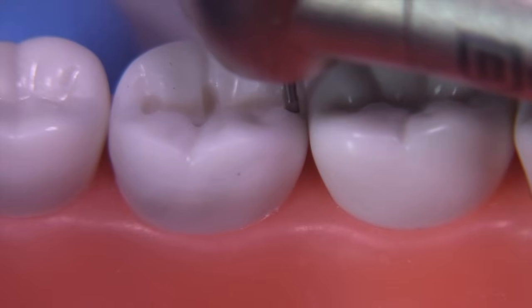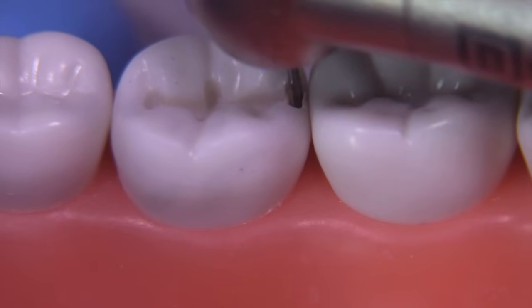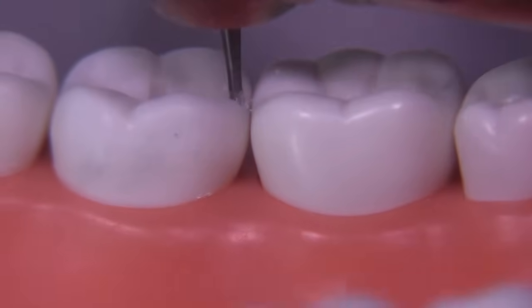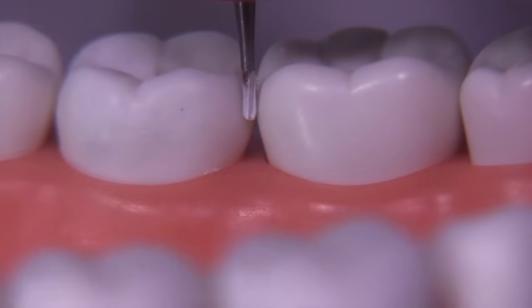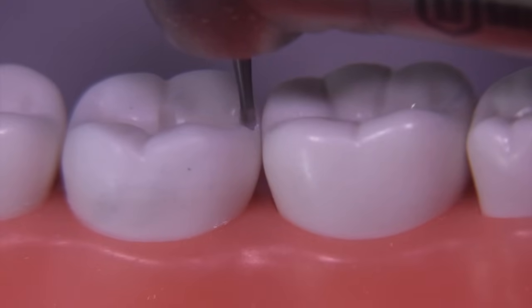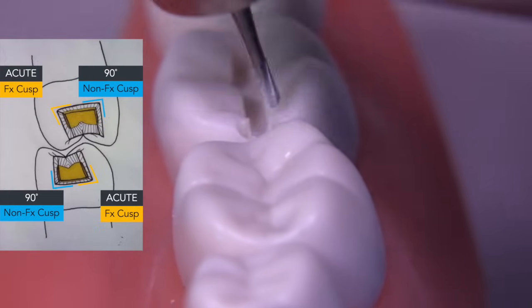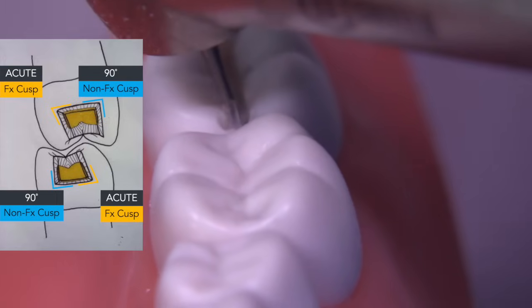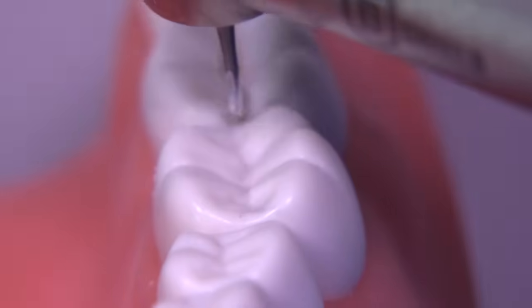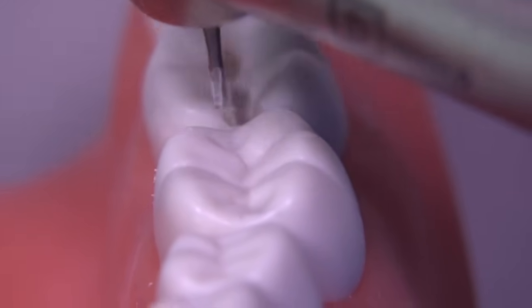If you hold the burr along the side of the tooth, you can get an idea — I'm going to have to go down the full length of the flutes on this one — and you can punch down there pretty quickly without fear of punching all the way through. One thing I want to point out that is oftentimes not understood is that the wall adjacent to the functional cusp is going to be slightly acute relative to the gingival, where the lingual is going to make a 90-degree angle relative to the gingival.